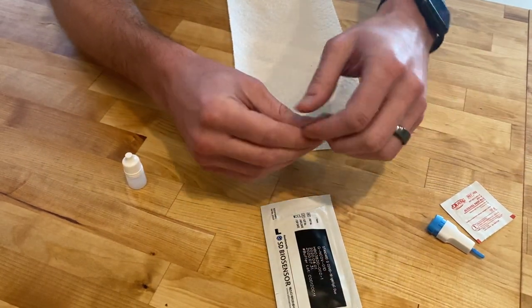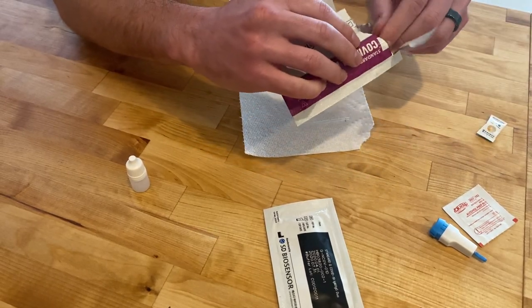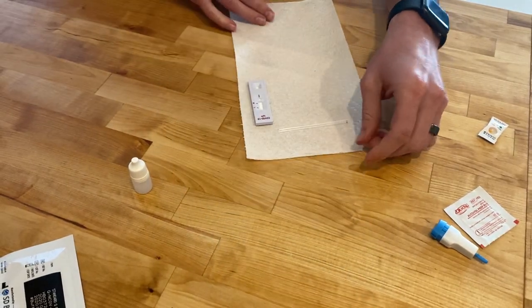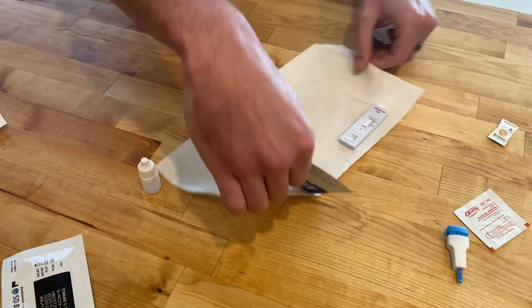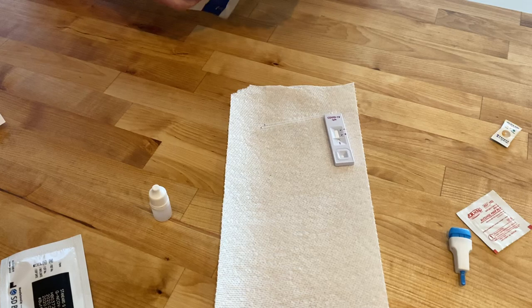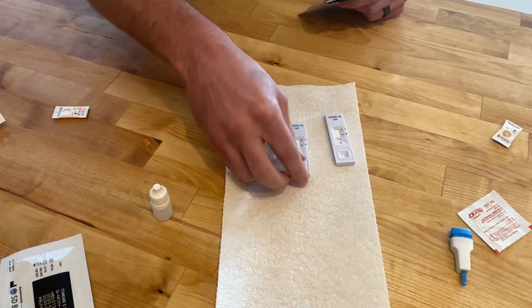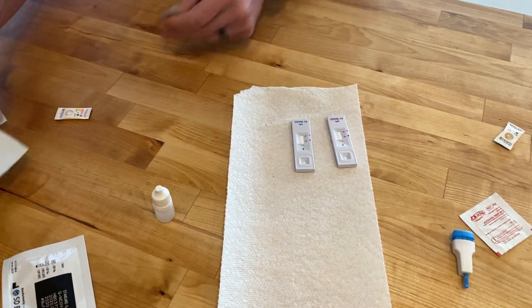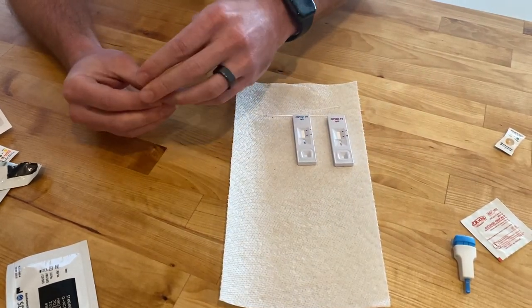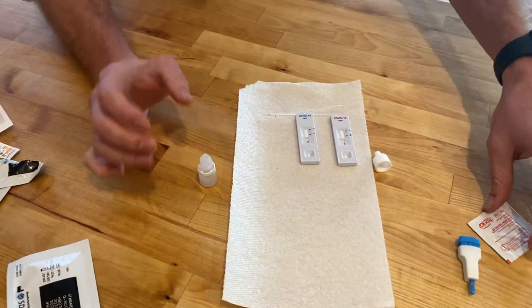So let's go ahead and open each of these. You'll be able to see this one has IgM — it's an IgM antibody. And this one has IgG. I'm going to try and do this upside down so you can see a little easier what's going on. I'll go ahead and have my bottle of buffer open.